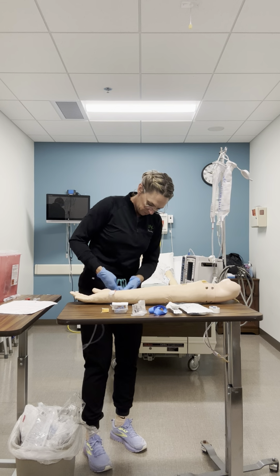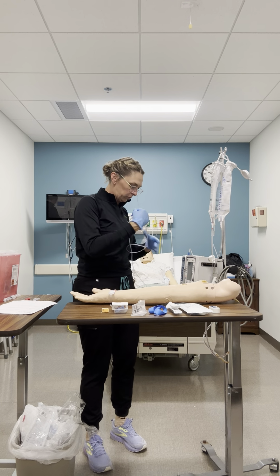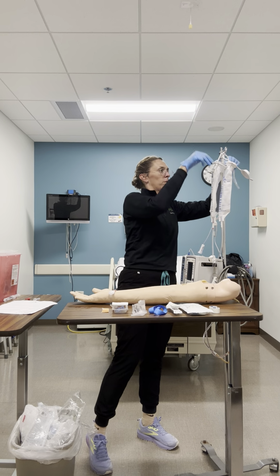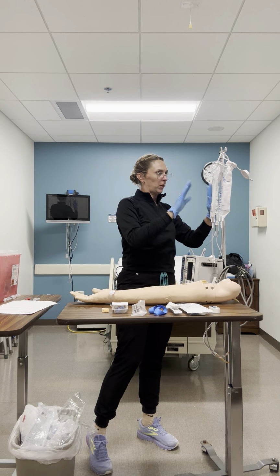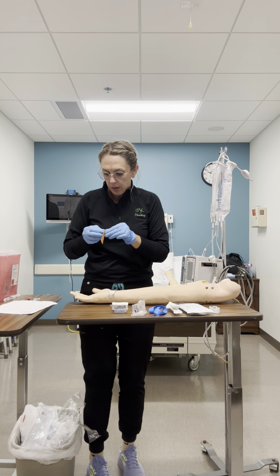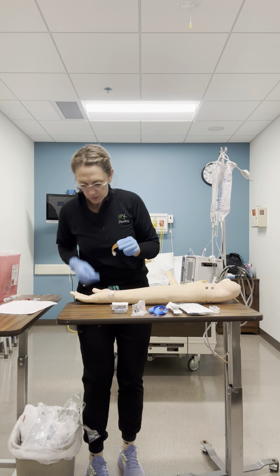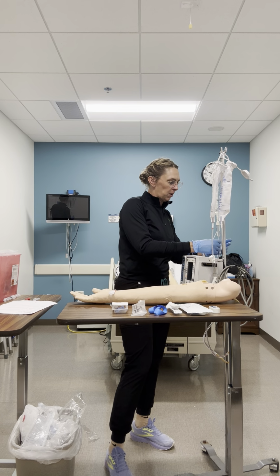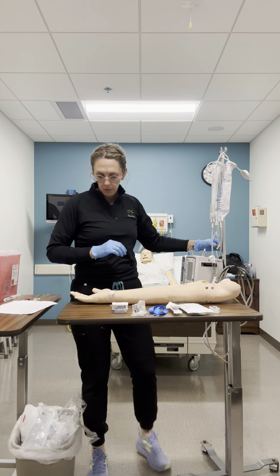Okay. My tubing is ready. Okay, so that is good and ready to go. I'm gonna now put my label on. This is per facility policy. And it's ready to go. Label is ready.